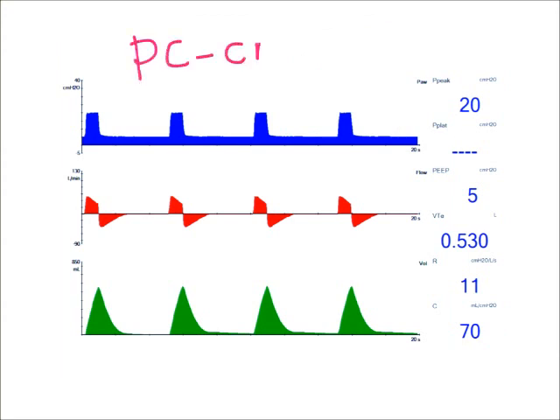So this is a screenshot and this is pressure control. Pressure control CMV. Since I do not have a set tidal volume, my tidal volume is going to be affected by my IE Ratio. And that is due to alveolar filling time and enough expiratory time. So how do we use our waveforms to evaluate IE Ratio?